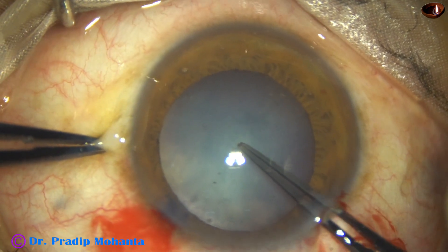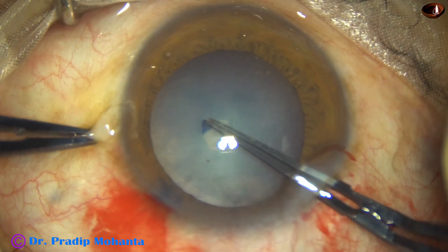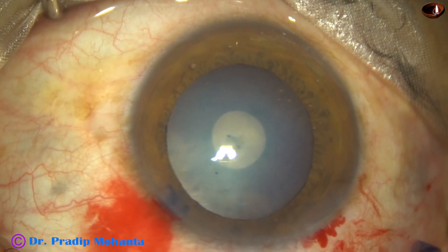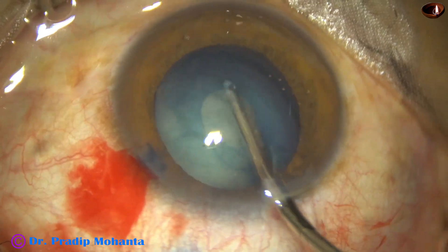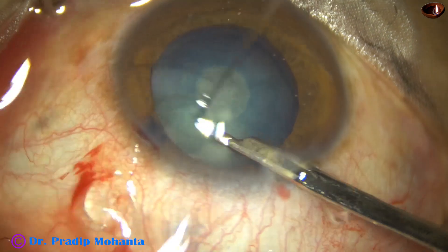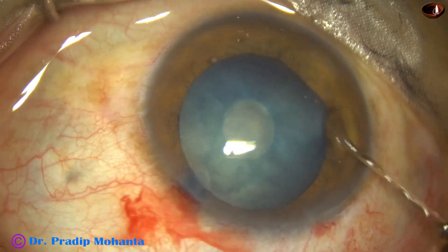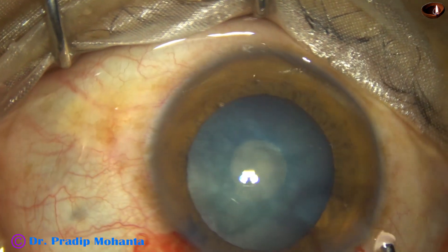My plan is to do a small rhexis first, then do some removal of lens matter to reduce the intralenticular pressure and flatten the anterior capsule, and then enlarge the rhexis. A small rhexis has been done. Now I am using a 23-gauge Simcoe cannula for removal of some lens matter so that convexity of the anterior capsule reduces and intralenticular pressure becomes less. As I inject visco, the anterior capsule will be almost flat.